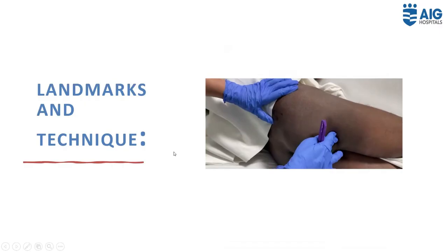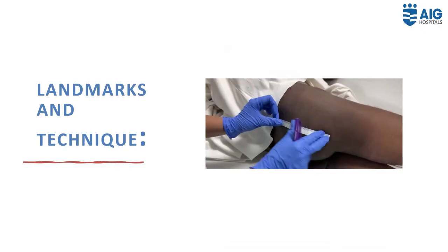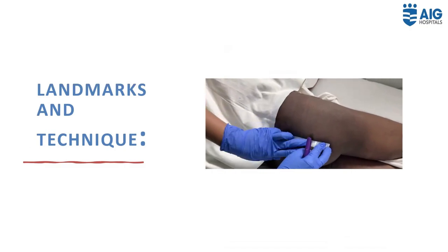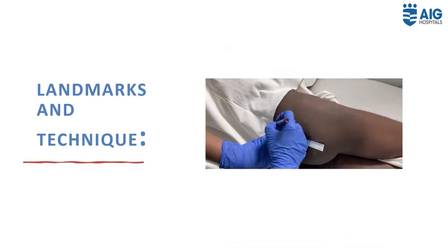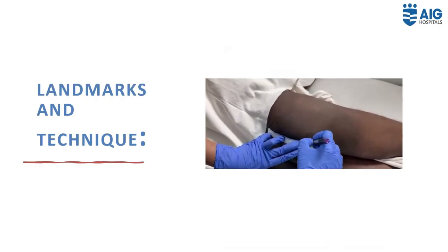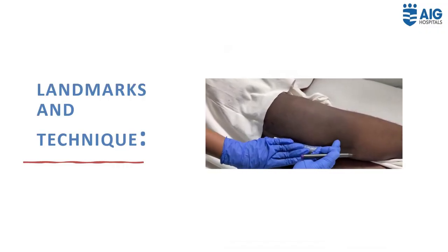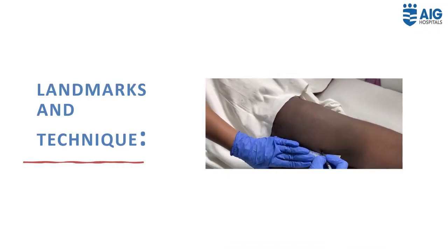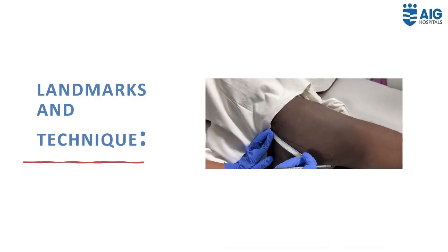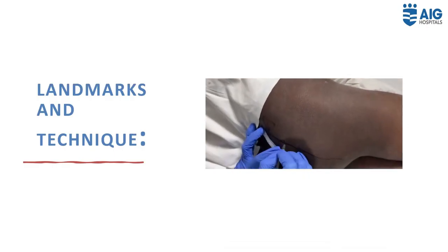A line is drawn between the posterior superior iliac spine and the lowest point of the ischial tuberosity. The needle insertion point lies 3-finger breadth or 6 centimeters inferior to the PSIS on this line. After all aseptic precautions and local anesthetic infiltration of skin, a 10 centimeter needle is inserted at the marked point perpendicularly. We'll now mark 6 centimeters along this line from the PSIS, and that will be the needle insertion point.